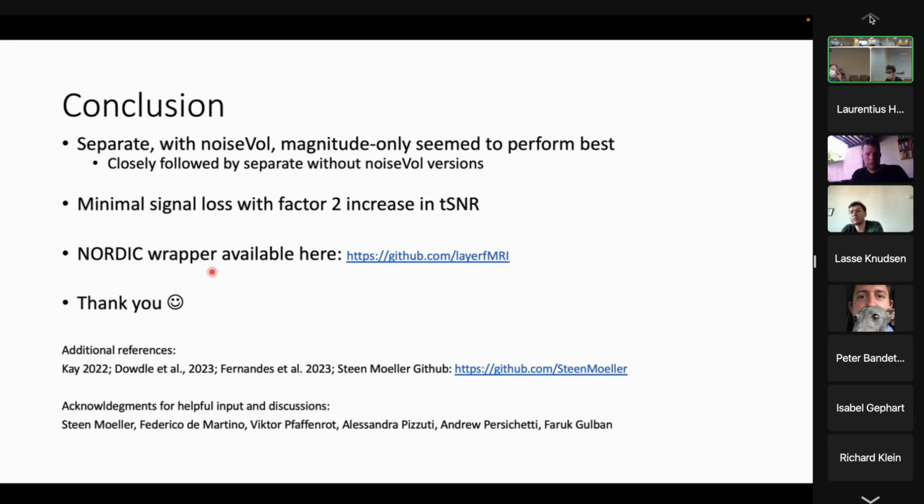patches, which I think is a very effective way in Nordic, that it kind of makes it small in space, and it forces it to use more time dimensions than space dimensions. But then on the other hand, for each voxel, you don't have one component, but you have the different patches that overlap. I think the underlying always big question is: is Nordic doing what it claims to be doing?